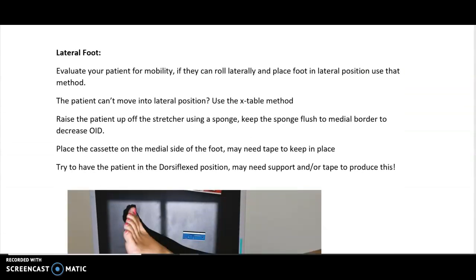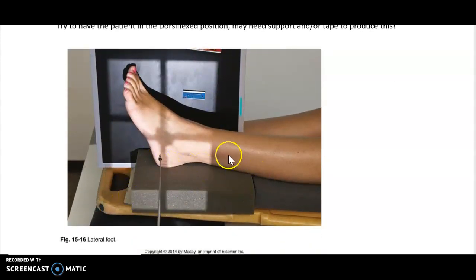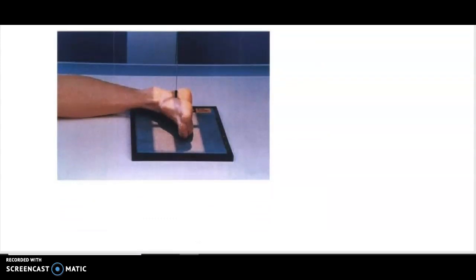For the lateral view, can the patient roll and do a lateral position like a normal patient? If they can bend their knee up and drop their leg out to the side, do a regular lateral. If they can't go lateral at all, use the cross-table method: put a sponge underneath to raise the part up off the table, place the cassette on the inside, and use tape, sponges, or sandbags to hold it flush to the foot. Try to dorsiflex the foot as you normally would — if they can't, use tape or support to assist. Get it as lateral as possible, and be aware of your SIDs so you're not too far away.